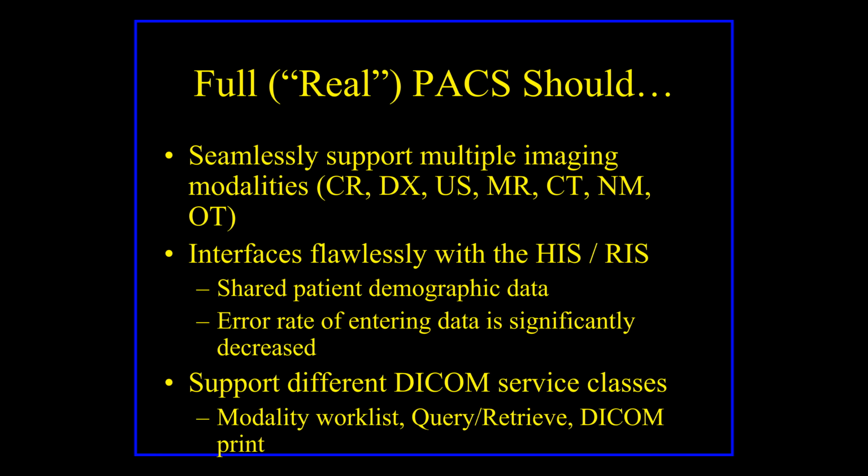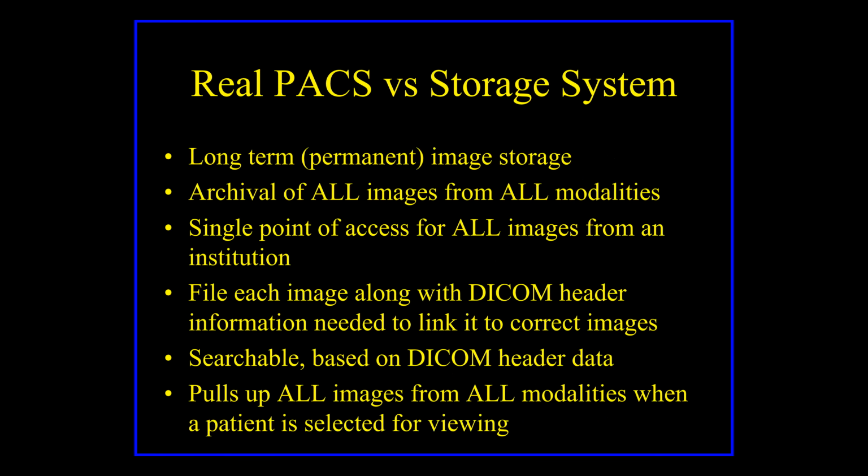Unfortunately, in veterinary medicine, some of the vendors will sell you what they call their PACS, but all it will do is x-rays. It's a picture viewer, and it will only show x-rays. It will not show anything with ultrasounds, it won't play ultrasound video clips, and you can't do any CT or MRI viewing. Even if you don't have CT or MRI in your practice, you're probably at some point going to send an animal out for it, and then you can get the images back and look at them. So it's still important.